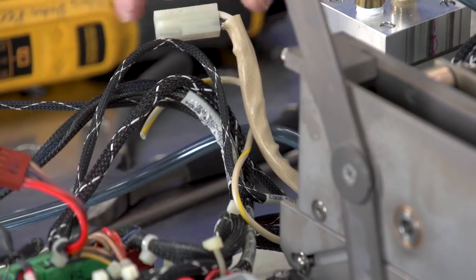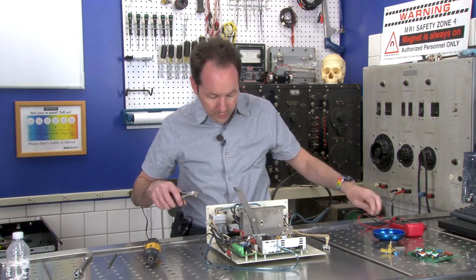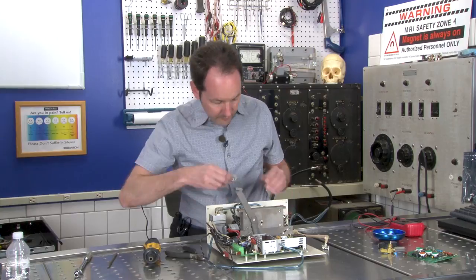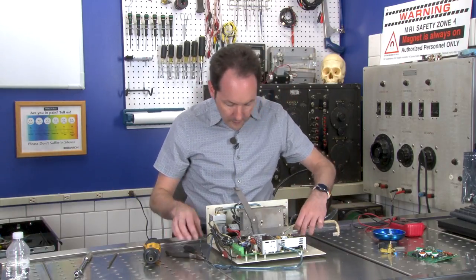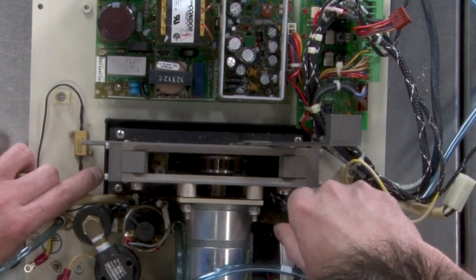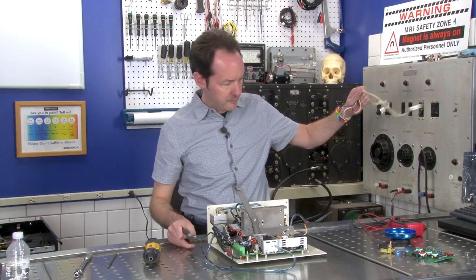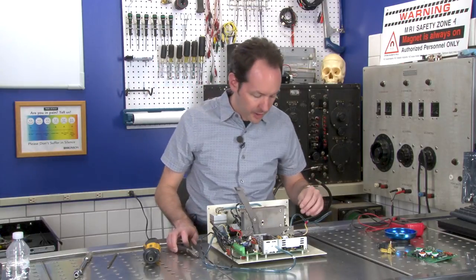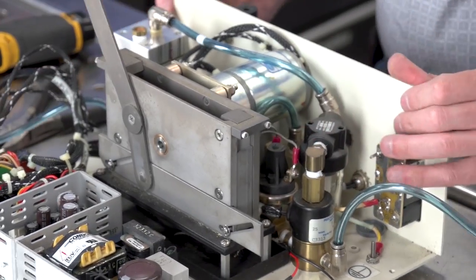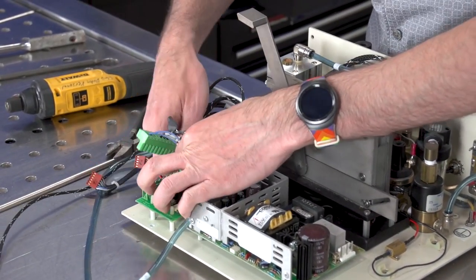There's a lot of ugly in here — all kinds of things, and judicious use of zip ties. We've got a lot of plugs out here to things we don't care about.